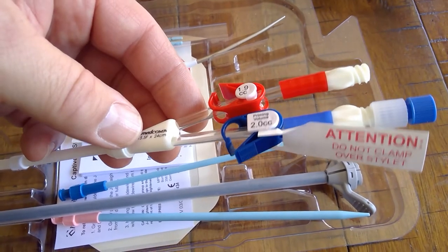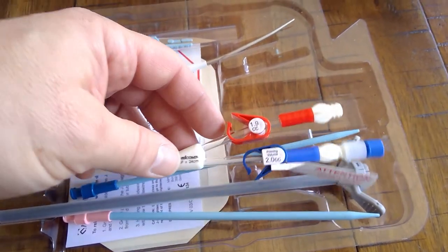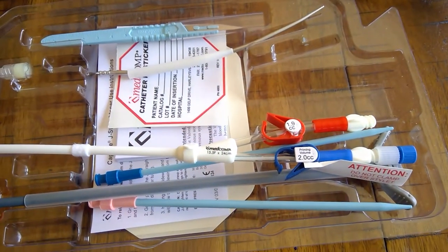That is only for exchanges. If you're doing a fresh placement you'll just remove the stylet, flush and lock both lumens, and insert this catheter through the peel away sheath.